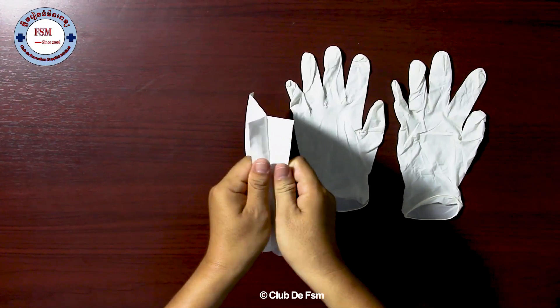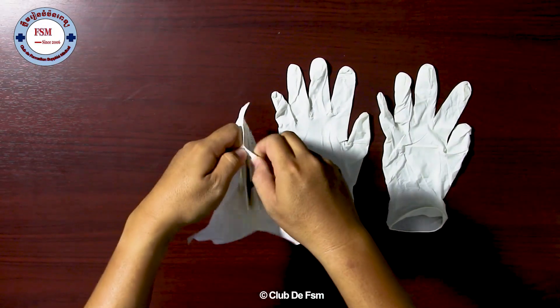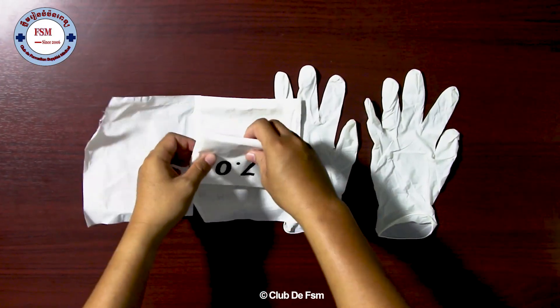When we are in an operating room, we do it like this. And then this is the non-sterile zone.